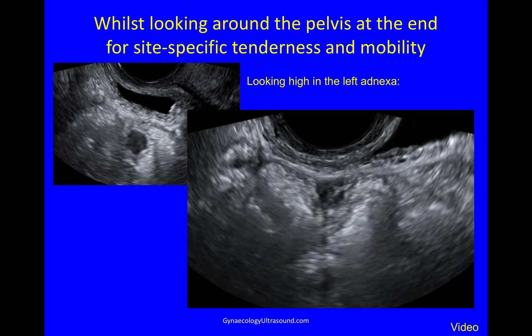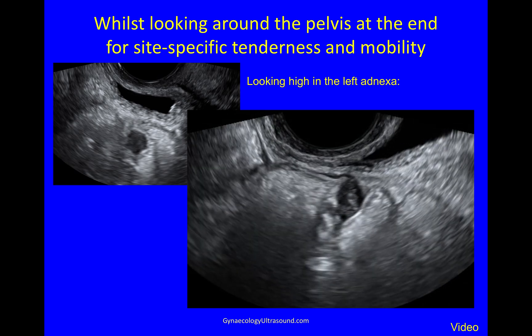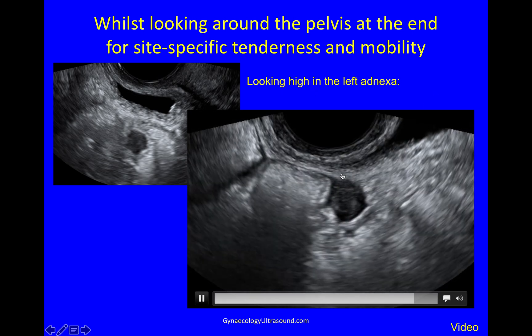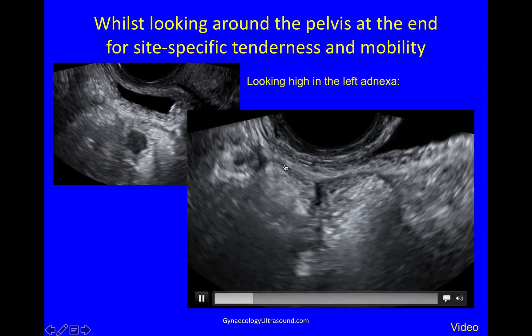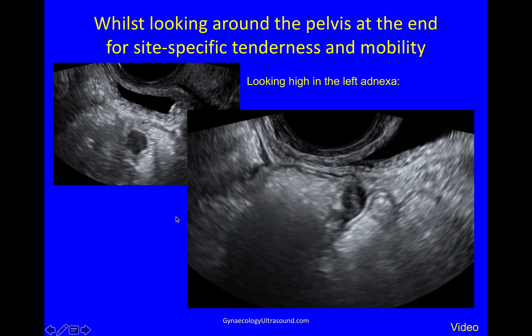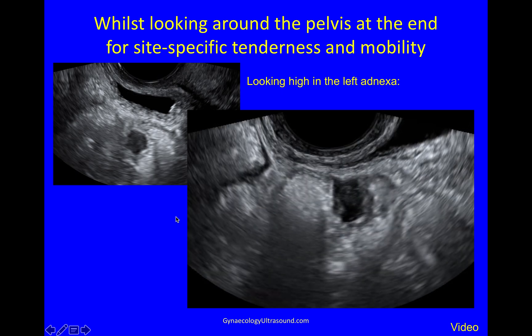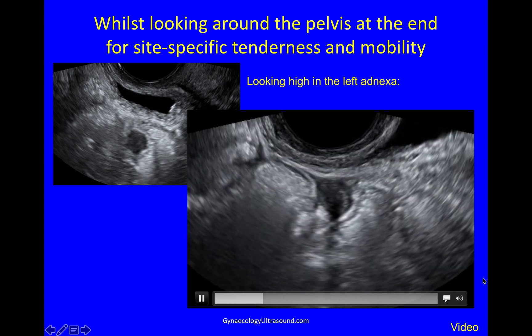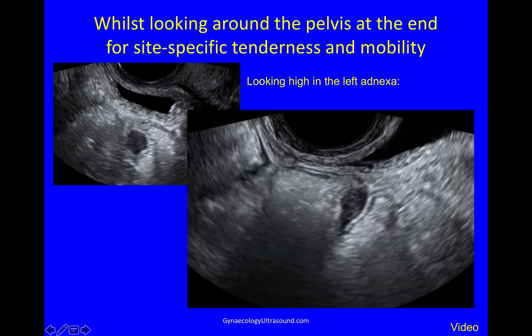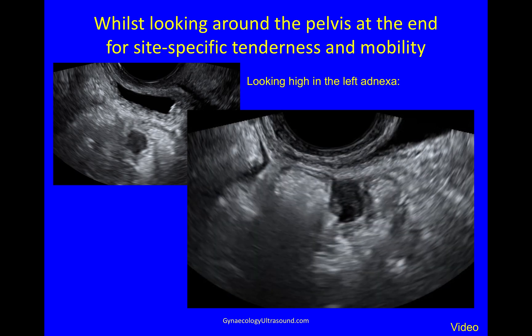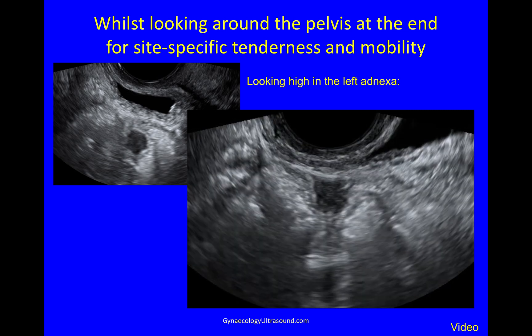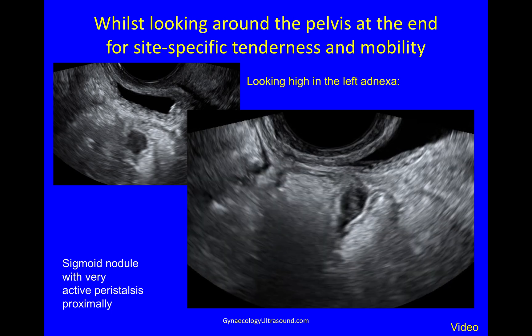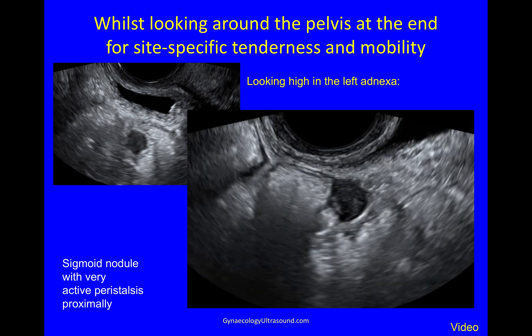Here's a video clip of that area. What you can see is just the edge of the bladder. You can see that this is entirely separate — this is in the bowel wall — and you can see a crazy amount of peristalsis around it. You can just see the white mucosa and submucosa overlying this nodule. So this is a very high lesion: a sigmoid nodule with very active peristalsis.